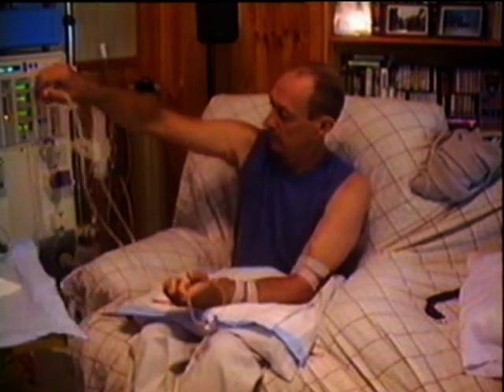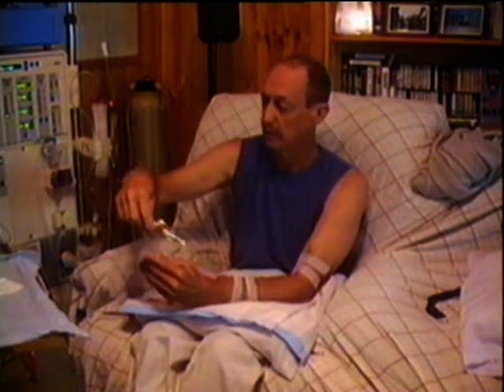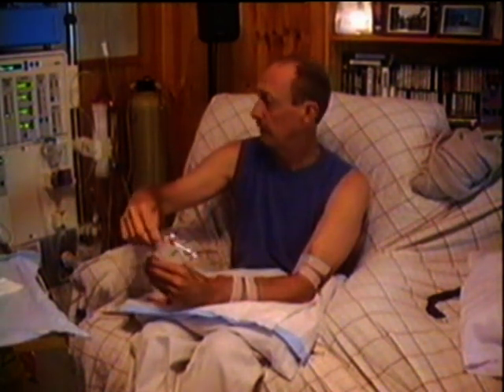Now we take our little loop, join it in part here. Pull that up here. We've got the — I've pulled the whole loop up here. Sorry, we've just been interrupted there.